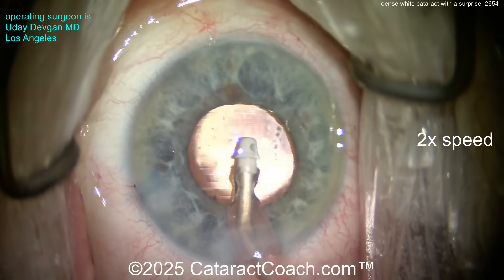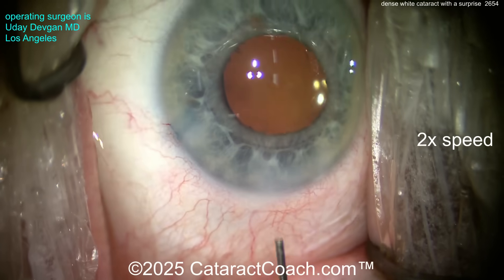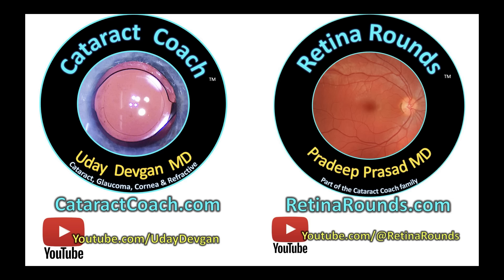Taking out viscoelastic — being pretty gentle, don't want to manipulate the bag too much. We've got a couple of areas of weakness where we had to cut the capsule, but look at that beautiful result. Of course the patient was amazed on post-op day one. Check out our sister channel retinarounds.com — so much great material even for cataract surgeons.